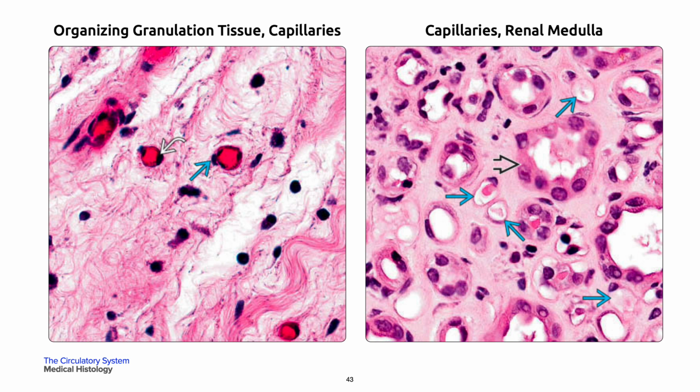response. By light microscopy, the endothelial cells in a curved white arrow and supporting pericytes are clearly seen in single blue arrow. On your right, these capillaries in single blue arrow are composed of a single endothelial cell circumscribing the lumen. They also run alongside the renal tubules in a bold black arrow and form part of the vasa recta, running parallel to the Henle loops in the renal papilla.